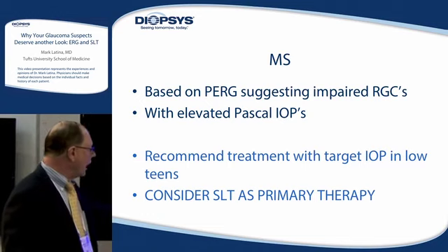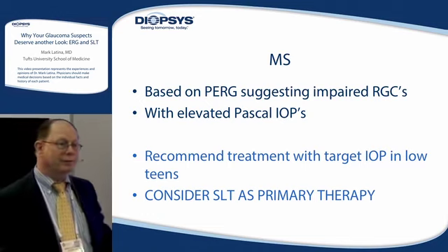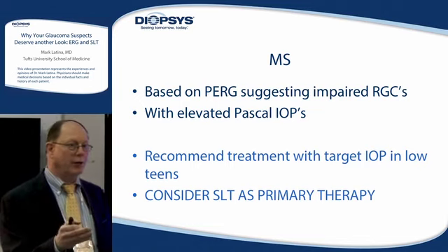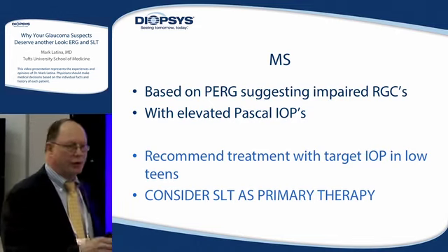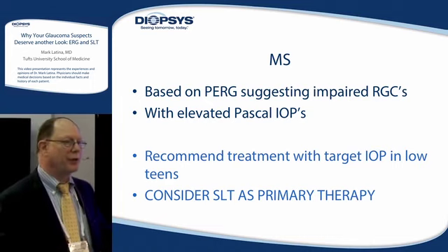So I recommended that we do get the pressures down, really looking at not only the applanation pressures, but the Pascal pressures. So we are looking at both of these, measuring the Pascal pressures. And I think in this case, one can consider, of course, medications, but we would consider SLT as a therapy for this patient.